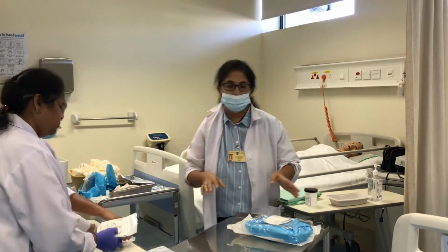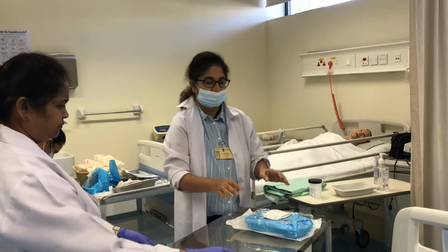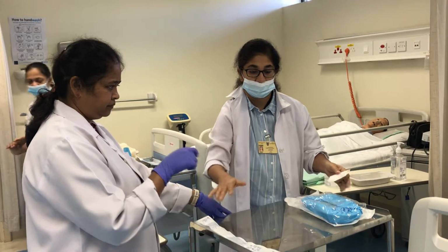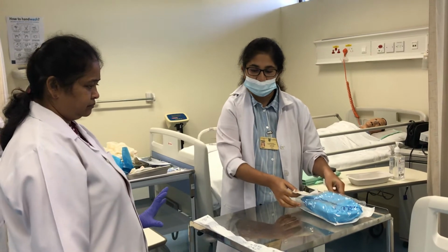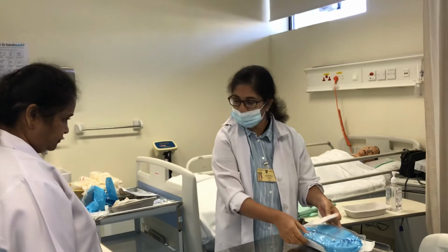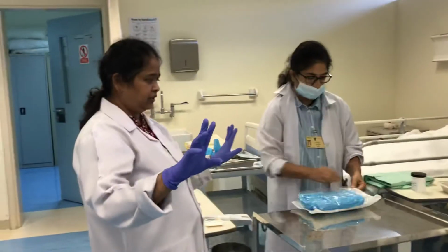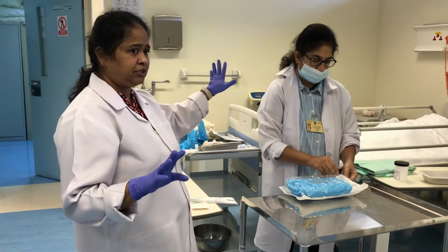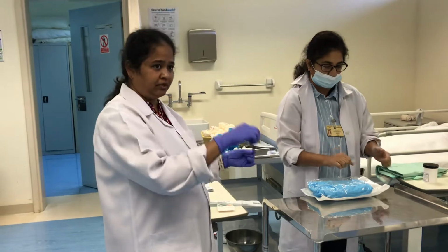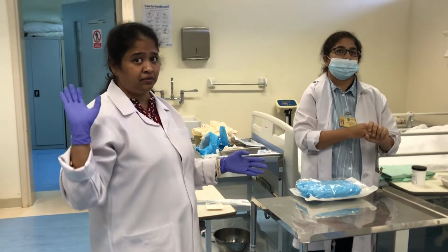Cleaning and all, she's not doing. Just like the other procedure, we have cleaned the catheter and we have cleaned the tray, and we need to open the tray. That is the next measure. As much as possible, 2 nurses will be doing it. So if she is the primary nurse, she'll go wash and come. By then the other person can open everything and put whatever is needed. All that we can do. It's allowed. This is how it is done in the hospital.